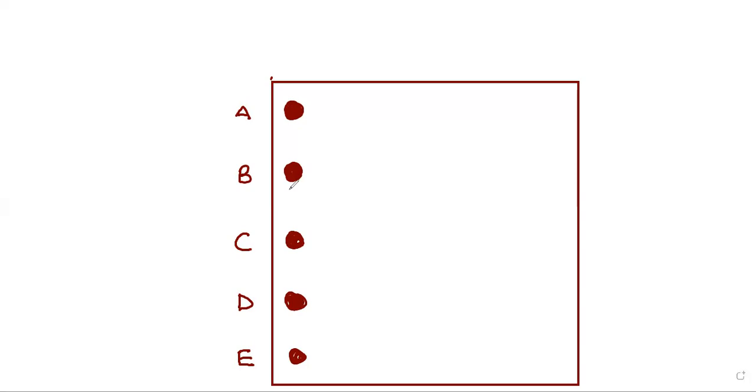Okay? They can run a certain distance and then they won't run again. For example, their speeds are actually put up here. What I used to remember is CSF, C, S, F, A. CSF, cerebrospinal fluid. What this tells us is that C is the slowest. It can only run up to this point. Do you get it?